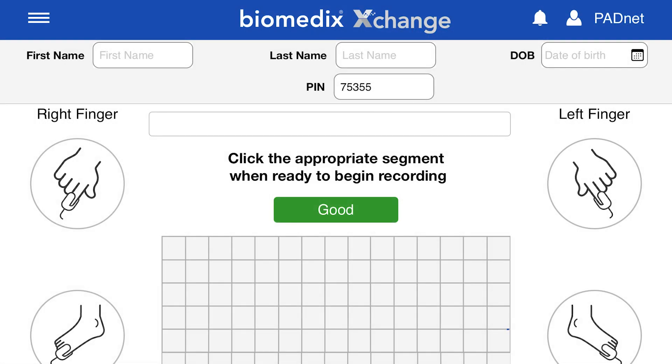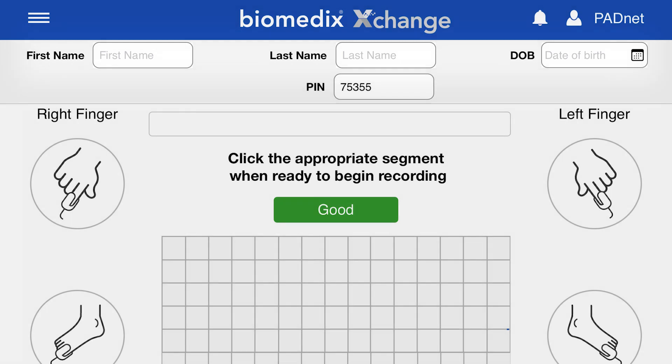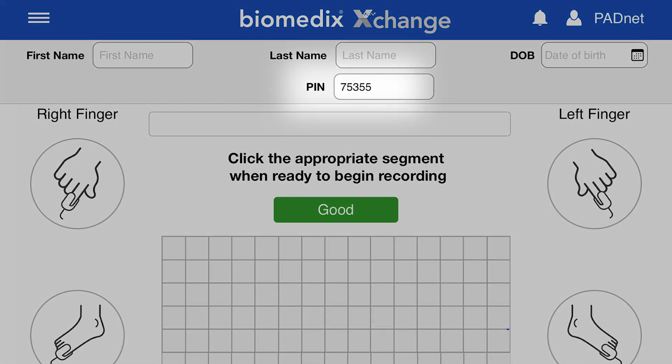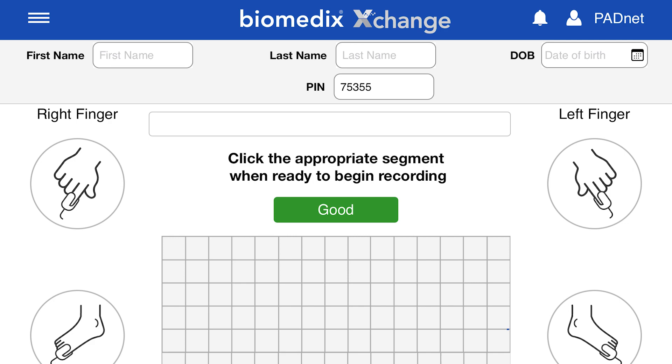While the patient rests, you can optionally input the patient's first name, last name, and date of birth. The test PIN will be automatically generated, but a custom value may also be entered if desired.